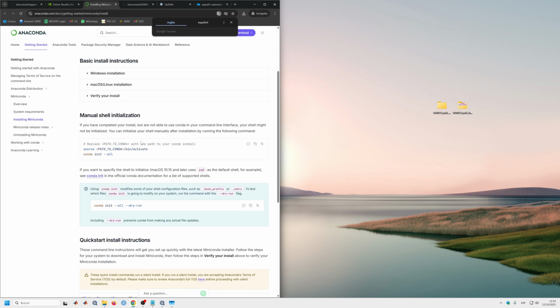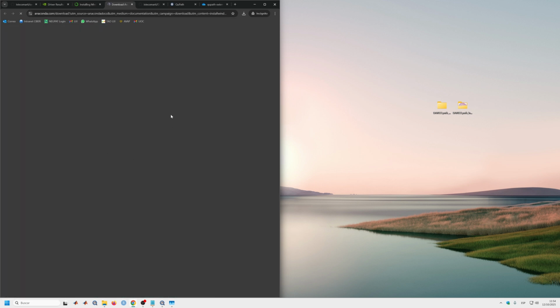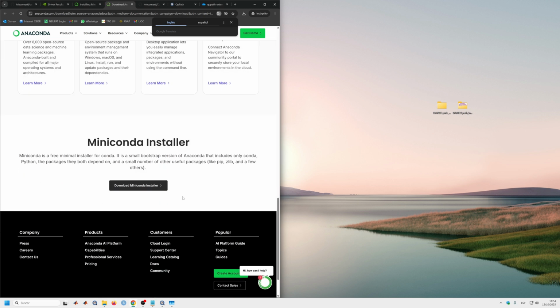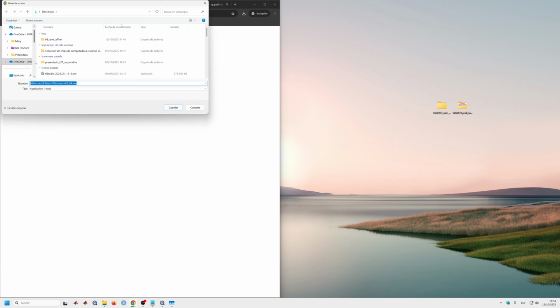and okay, so Windows installation, and now we come here, download Miniconda installer, download, and in downloads.